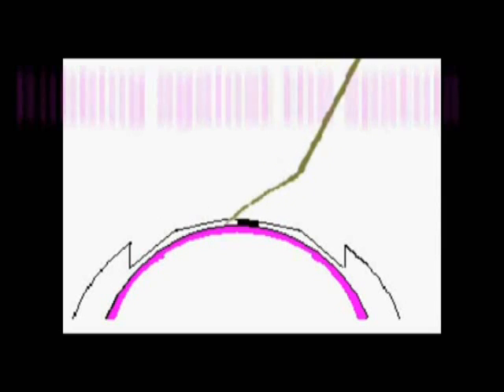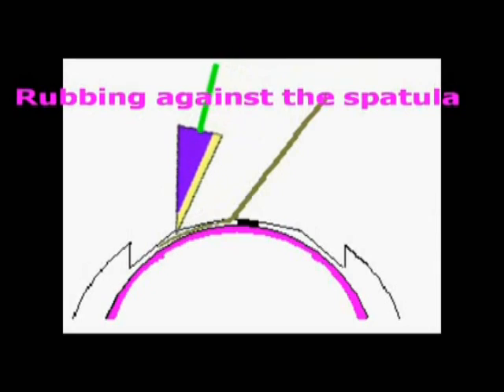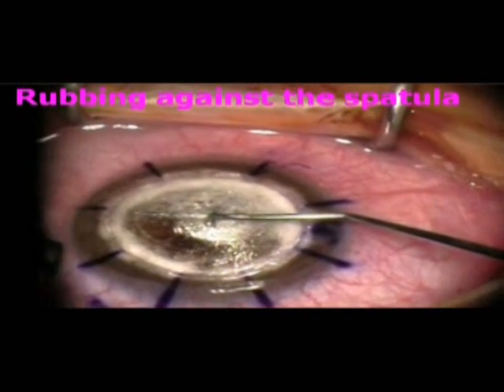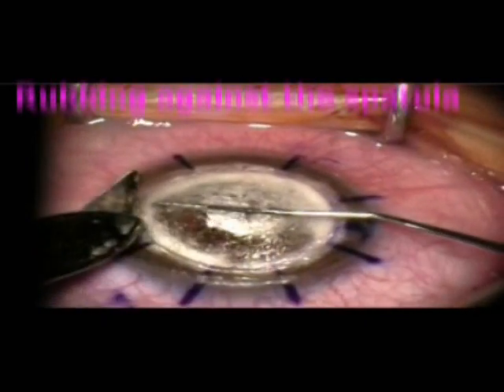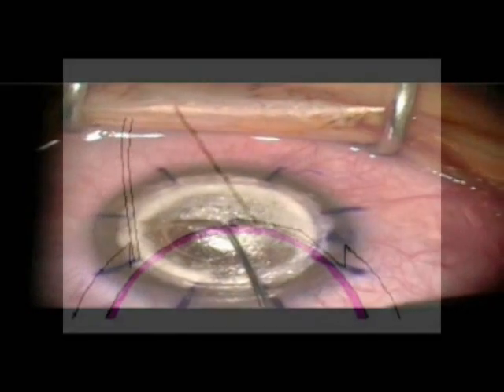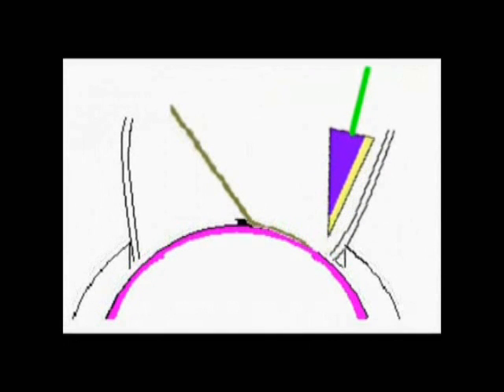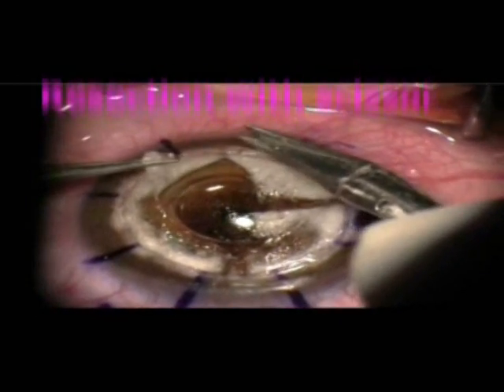We introduce the spatula in an easy way. The stromal remains are cut by rubbing the knife against the spatula and the bare descemet is exposed. We resect the stromal remains with scissors.